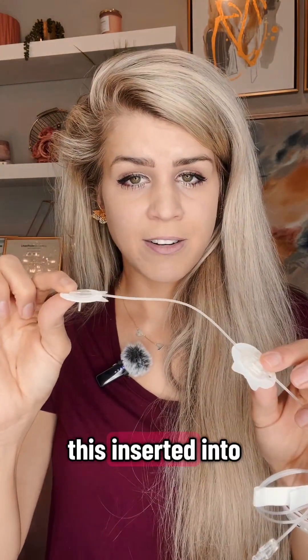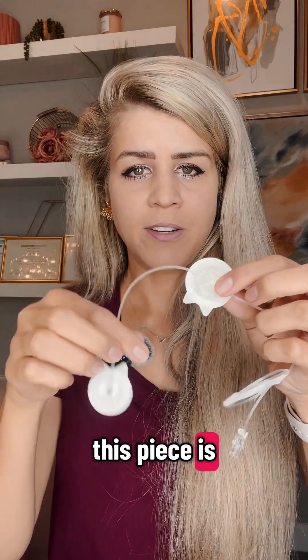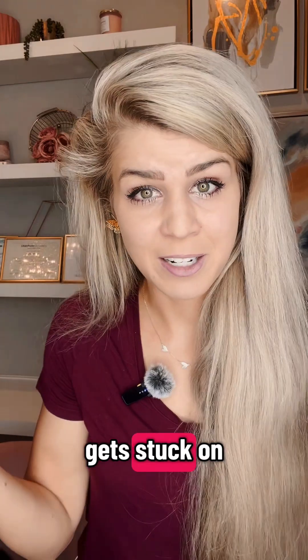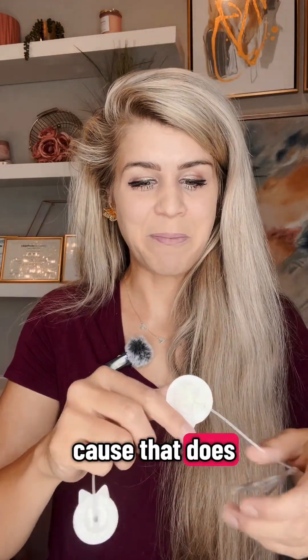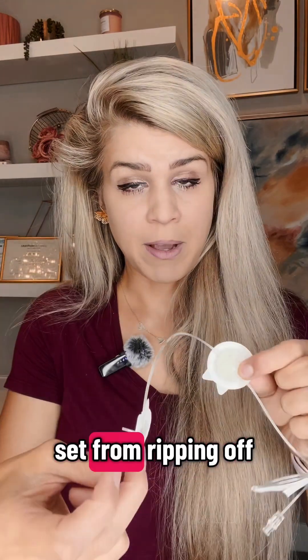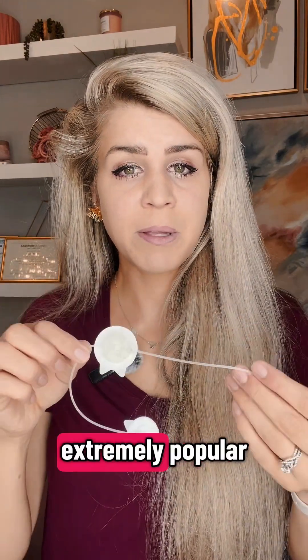Once you have this inserted into your body, this piece is to secure the metal needle. So if somebody were to pull on your pump, or if you get stuck on a doorknob — because that does happen — it would keep the infusion set from ripping off. So this is extremely popular.